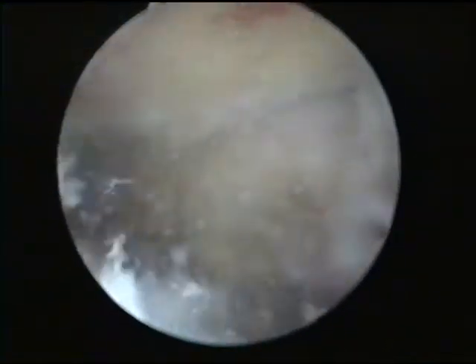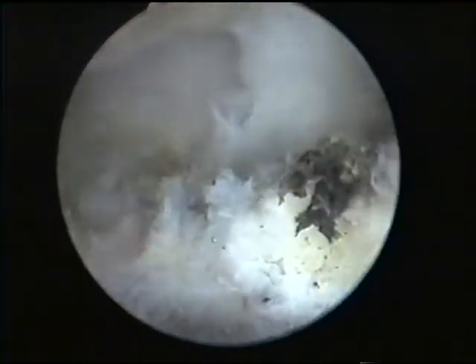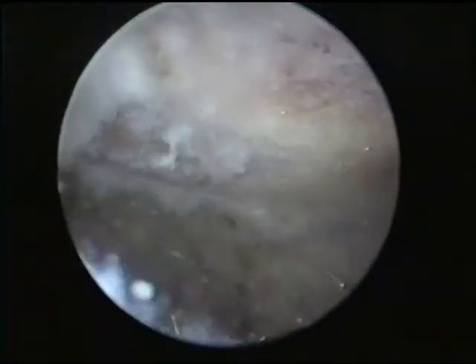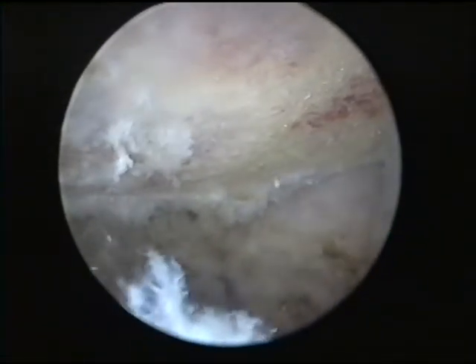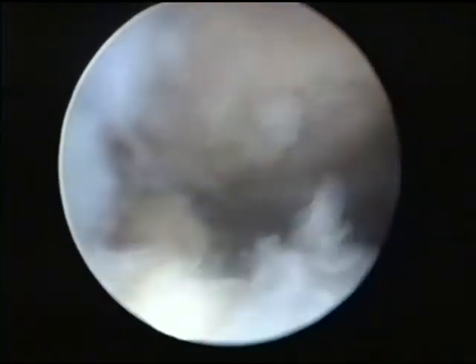Lisa? The AC joint is right there. You can see it moving. It looks pretty good. No microscopic bleeding is expected.